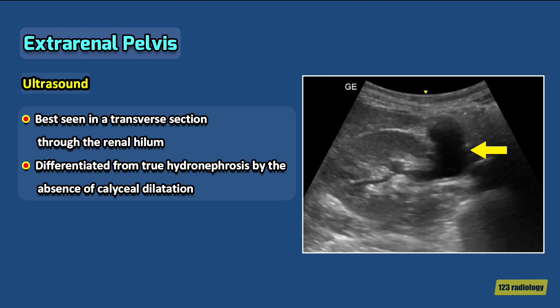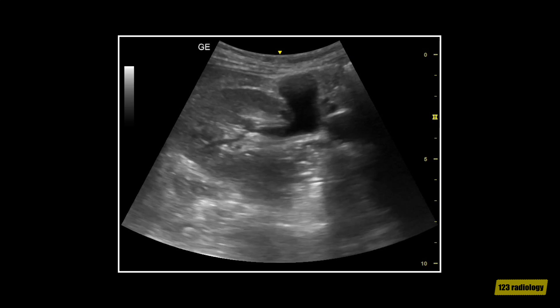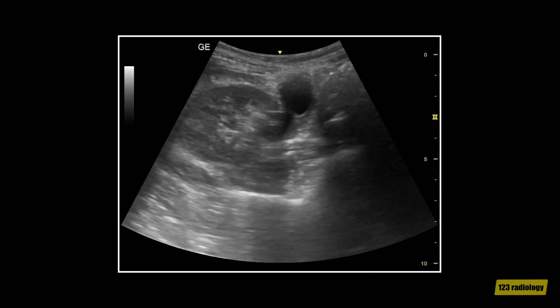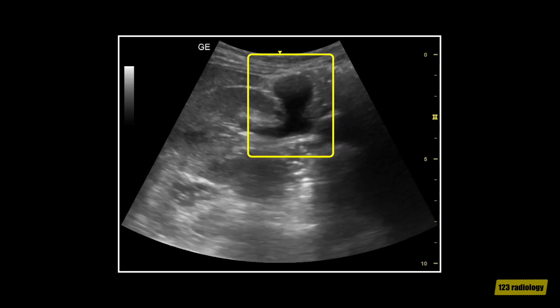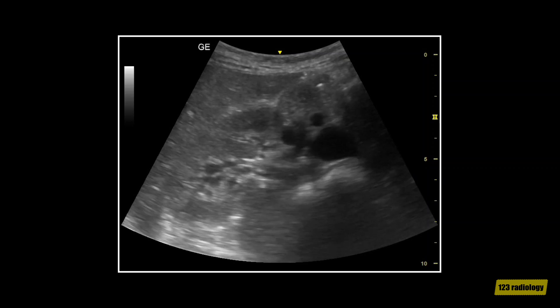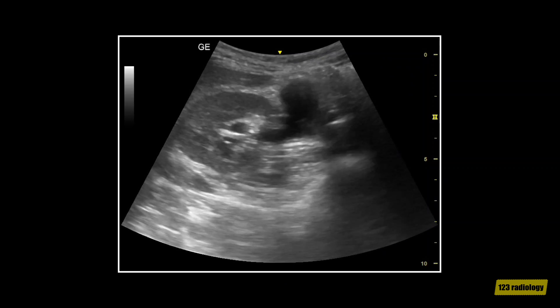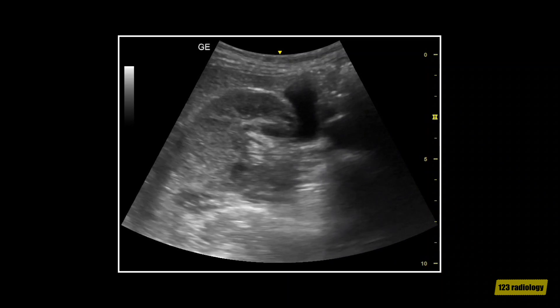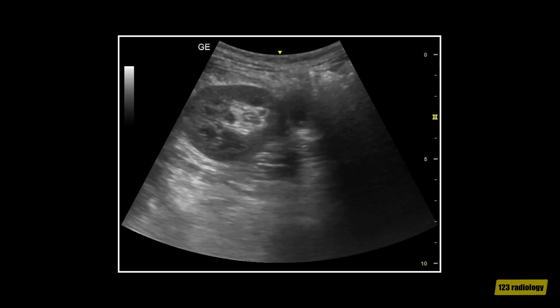On ultrasound, it is best seen in a transverse section through the renal hilum, as you can see in this image. It can be differentiated from true hydronephrosis by the absence of calyceal dilatation. This video clip shows a transverse view of the right kidney through the renal hilum. It demonstrates a baggy extrarenal pelvis. The renal calyces are not dilated and the renal parenchyma is preserved, confirming the diagnosis of extrarenal pelvis. This should not be confused with hydronephrosis.